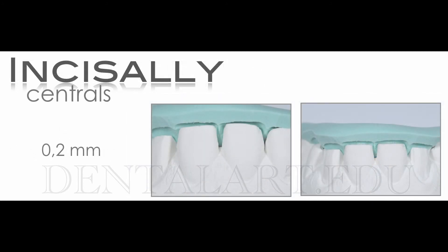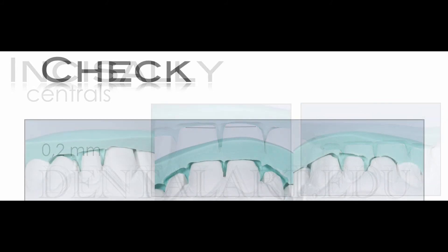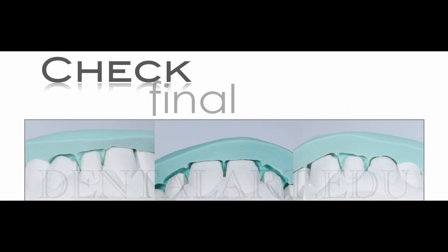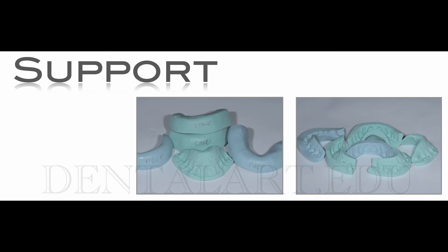Very close to the lateral configuration. On the centrals, we don't need prep veneers — we don't want to touch the tooth at all. We want to stay in the enamel. Enamel is a marvelous material — a fantastic background on which to start layering ceramic on top. We need only 0.2mm incisally. Everything is checked carefully and accurately, going step by step with the technical procedures to achieve the final result in the mouth.